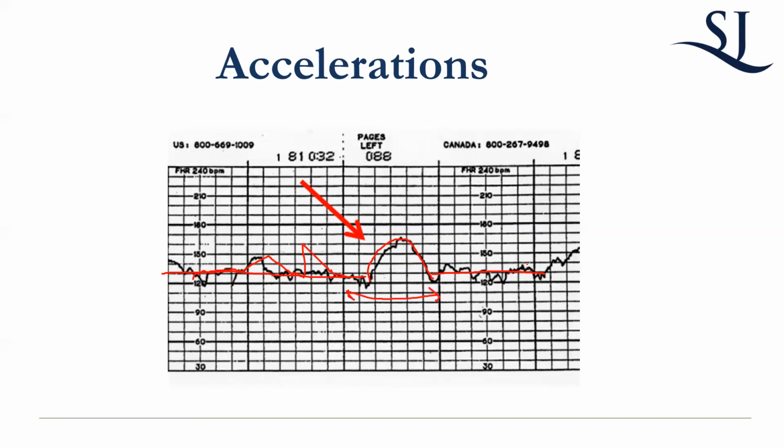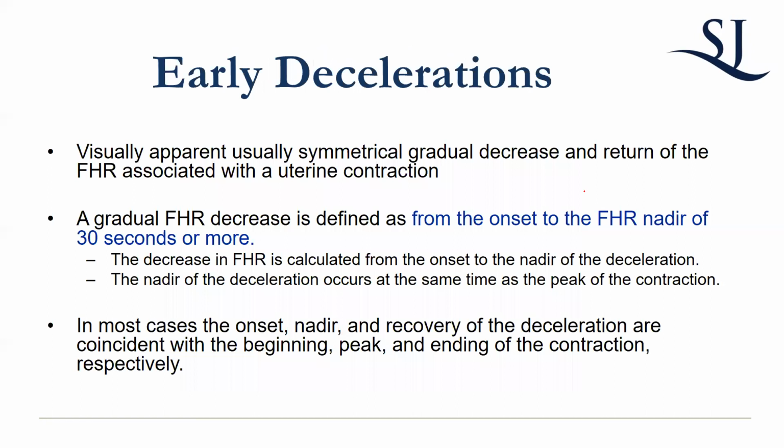For a laboring patient, accelerations can be there or not. If you don't have accelerations, that doesn't mean there's a problem. When you're talking about antepartum testing, meaning that the patient's pregnant but not in labor, you do want to see accelerations for it to be reactive. And I'll get into that a bit. Accelerations you don't care about. A deceleration, it really depends on how bad it is, and I'll show you an example of that.